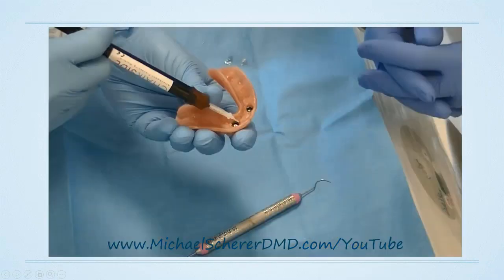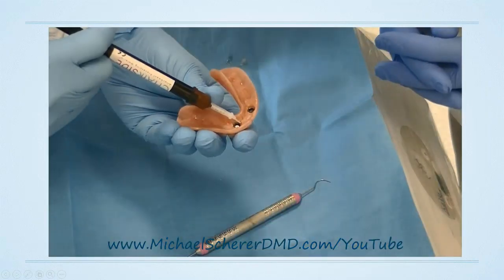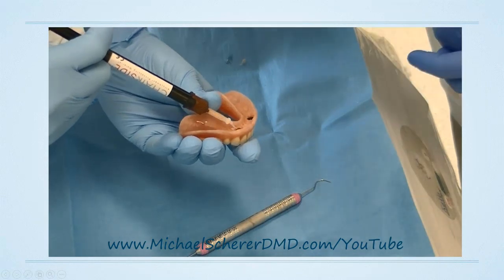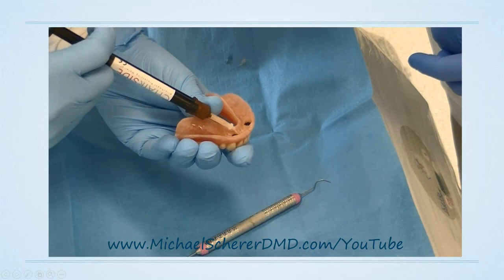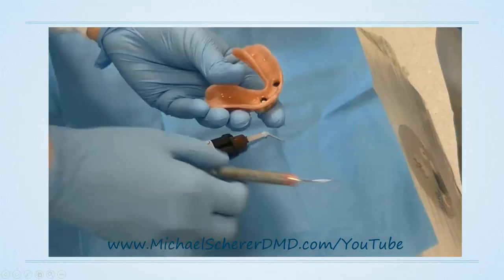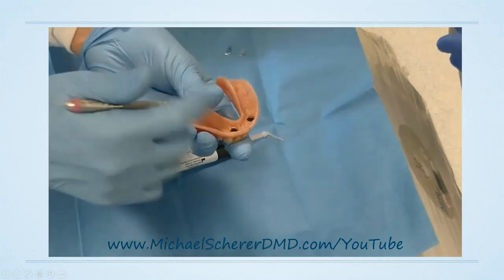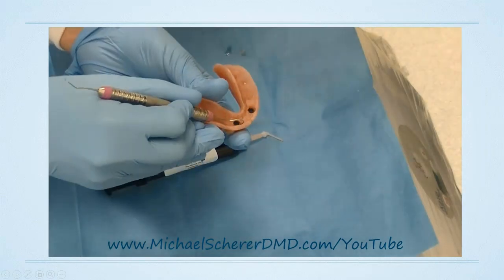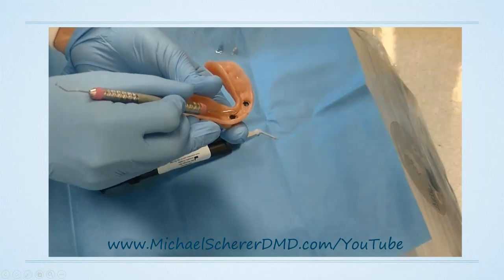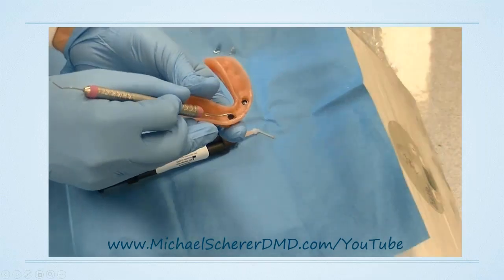Now what I'm going to do is use some of my composite resin, filling in some of those little grooves and voided areas. I'd rather have a little bit too little than a little bit too much for my initial procedure, because I can always add some of this material. If you dry off your locator housing really well, there's a very good chance that you're never really going to have to worry too much about not picking these things up.